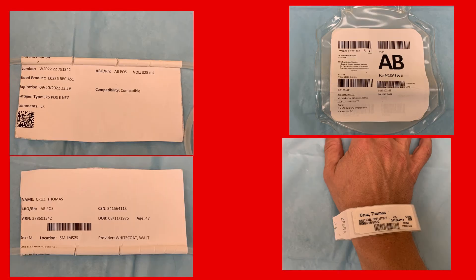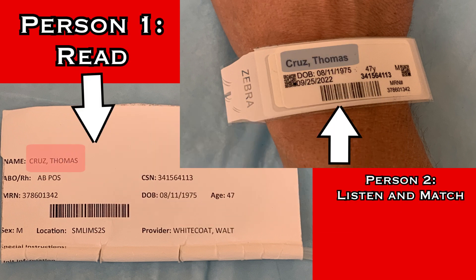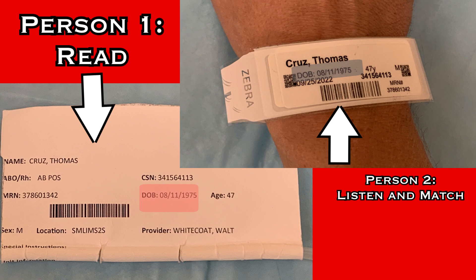Begin by verifying the patient. One person will read from the sticker attached to the blood product, while the other listens and matches that to the patient's wristband. Read and spell the patient name. I have Thomas Cruz, T-H-O-M-A-S C-R-U-Z. Read the birthday: date of birth 8-11-1975. And read the MRN: MRN 378-60-1342.